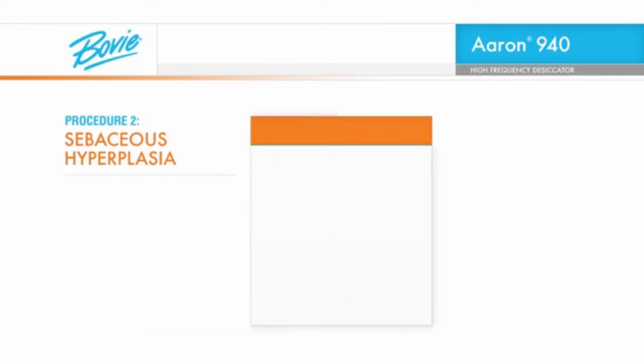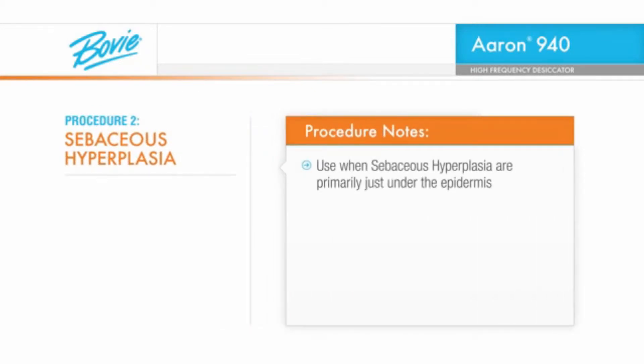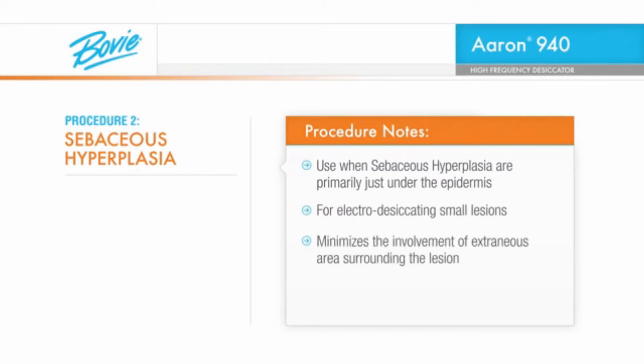When treating sebaceous hyperplasia that are primarily just under the epidermis, the following technique is very useful for electrodesiccating the small lesions, minimizing the involvement of extraneous area surrounding the lesion. Local anesthesia for minor lesions such as these is not required.